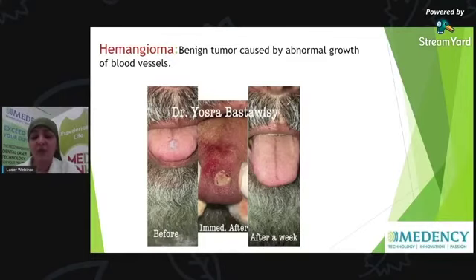And by the way, this is one of the contraindication cases for photobiomodulation. You cannot do photobiomodulation after hemangioma removal because you don't want to regrow the cells and have the blood recur in this area.